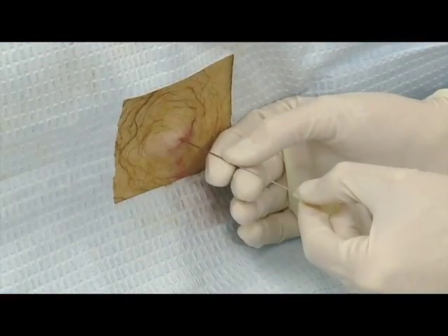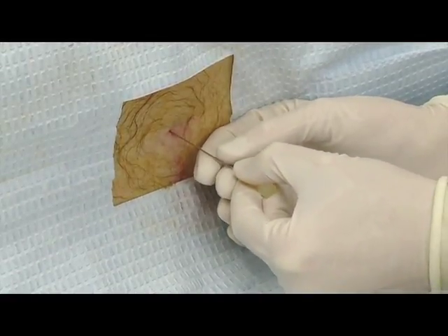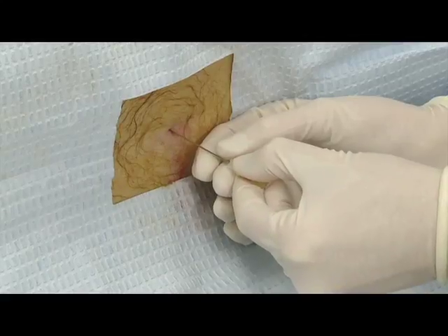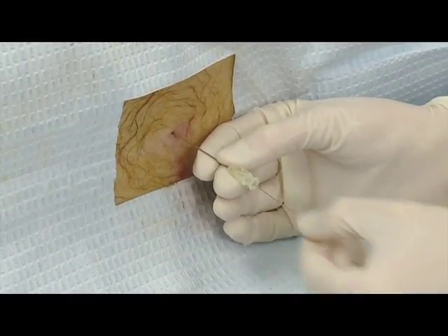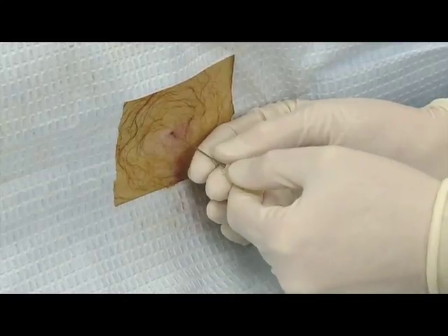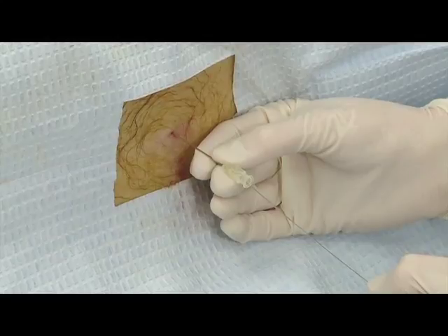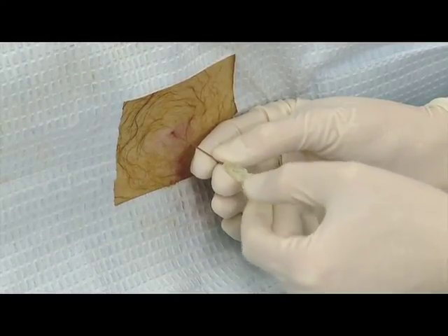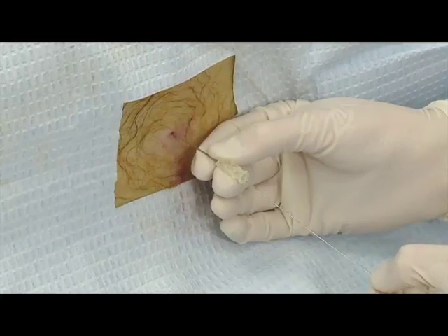You may feel a pop when passing through the ligamentum flavum, followed by a reduction in resistance as you enter the spinal fluid-filled space. Once in the subarachnoid space, remove the stylet completely to assess for CSF flow. If no CSF appears, advance the needle about 2 millimeters and withdraw the stylet again. This process may be repeated.